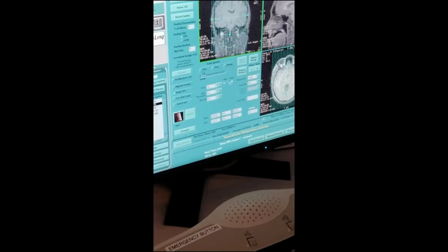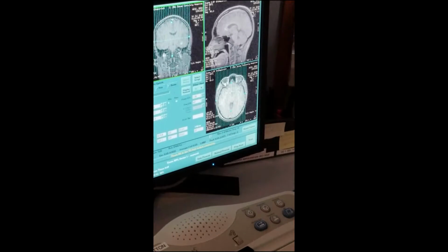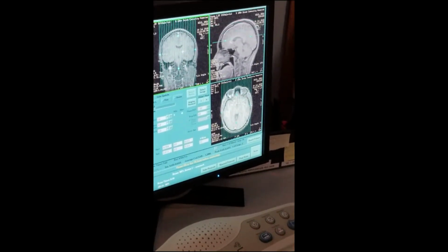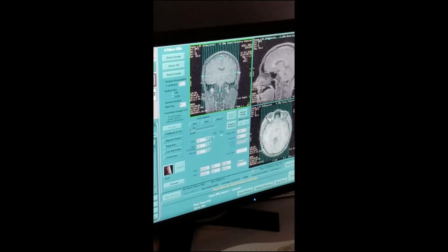I don't like what I see though. Because this side has a few slices and this one has too many. Okay, then adjust. Because if you adjust that, then you're going to come off of my center. You might want to bring one more line out. Yeah, see, I just centered it for you into the ventricle. So then you need to maybe add one more line.